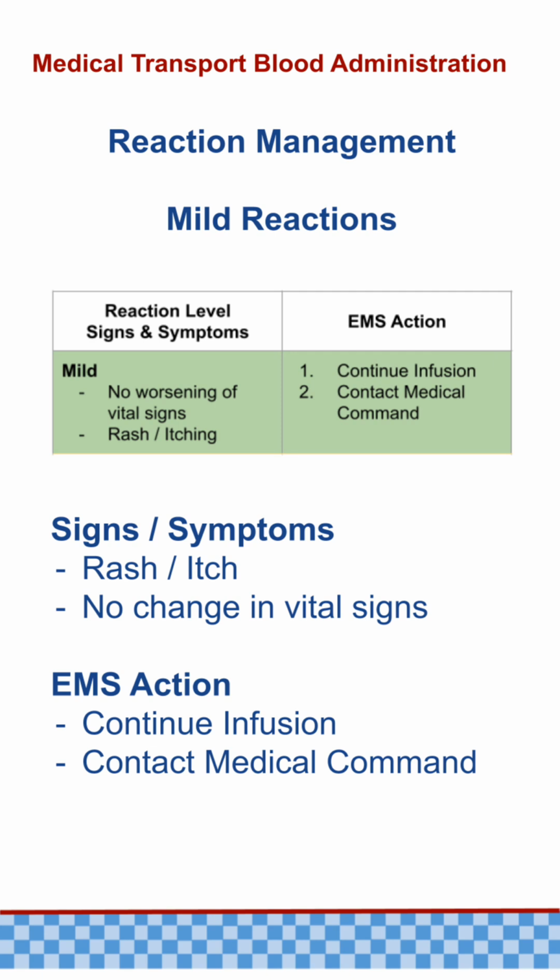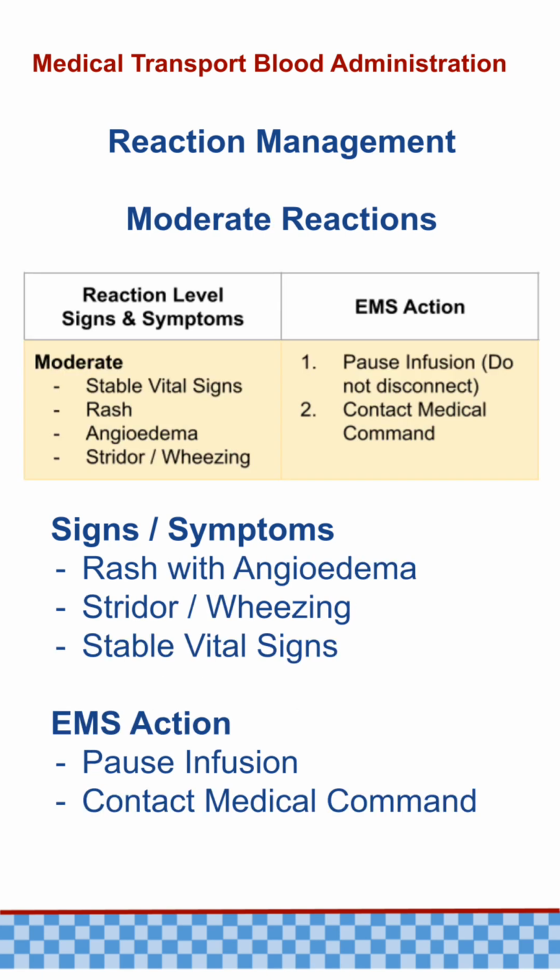Mild reactions may present with a rash or itch. The rash or itch may be localized to the infusion site or develop in other areas of the patient's body. If the patient presents with signs of a mild reaction, continue the infusion and contact medical command at the receiving facility, if possible.